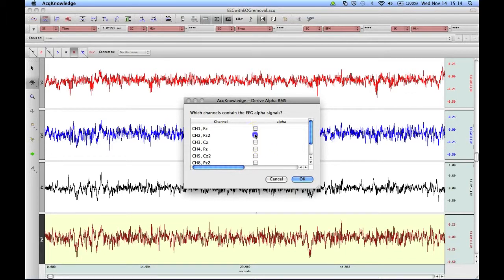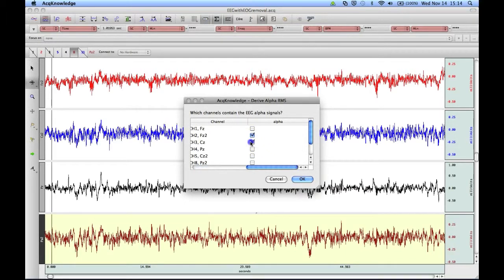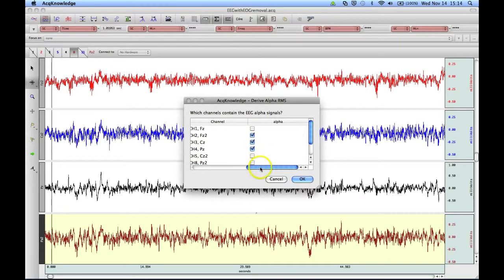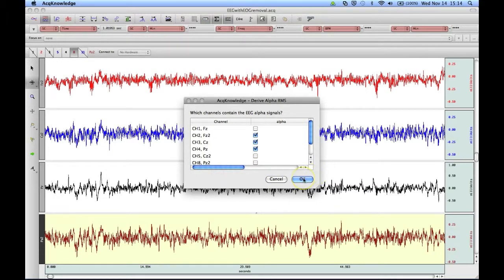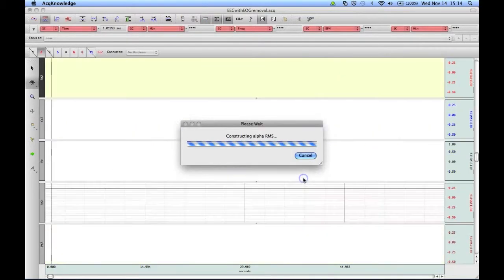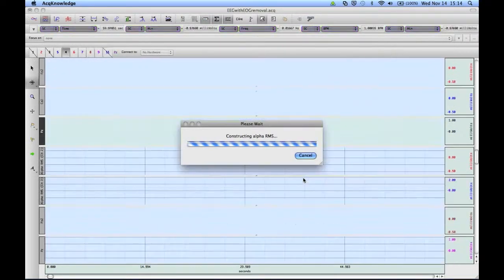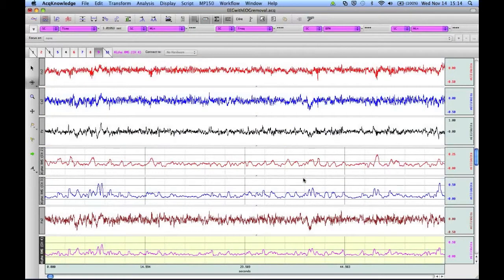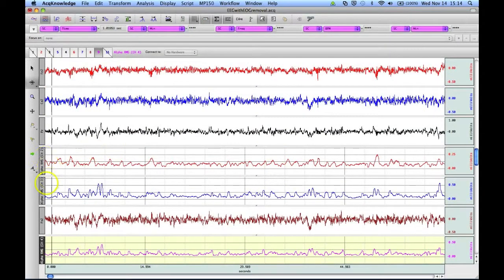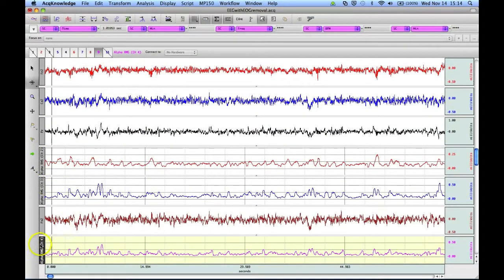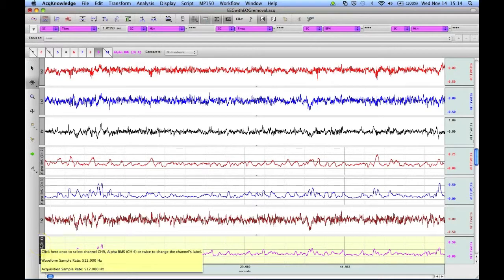We can then select which channels we would like to include in the Derive Alpha RMS analysis routine. You can then click on OK, and it will construct the Alpha RMS for each of the EEG channels that we've selected.